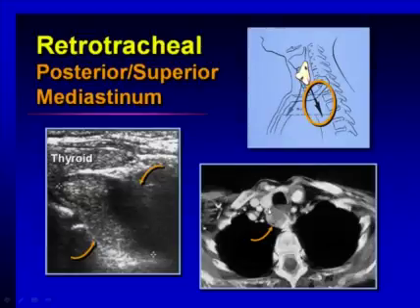If we angle through the thyroid gland, we can often see these large masses here, this one located adjacent to the cervical spine. And they tend to be missed sometimes at initial operation because the surgeon may be reluctant to explore deeply in the neck because of nerves and other important structures, and these may be present when we look at these patients for reoperation for persistent hyperparathyroidism.